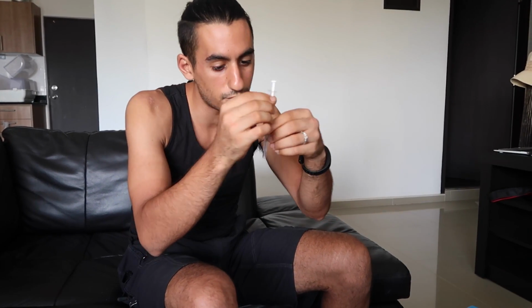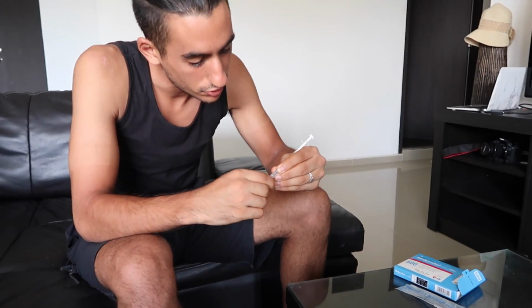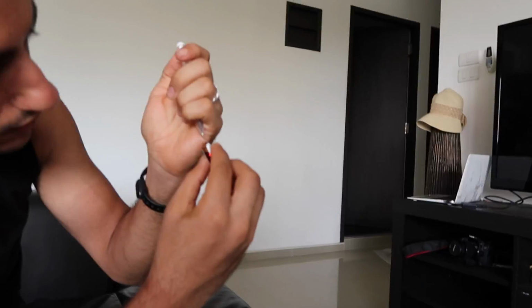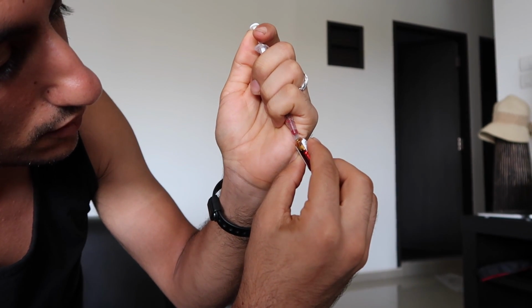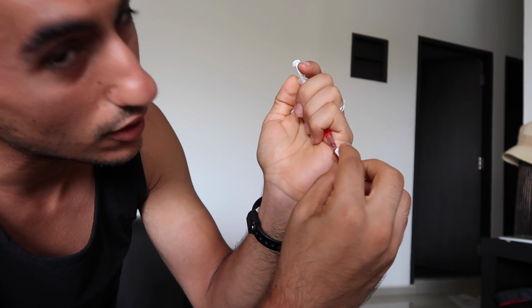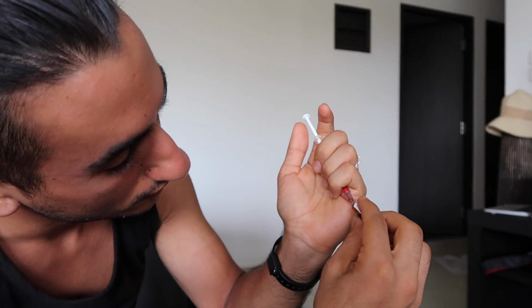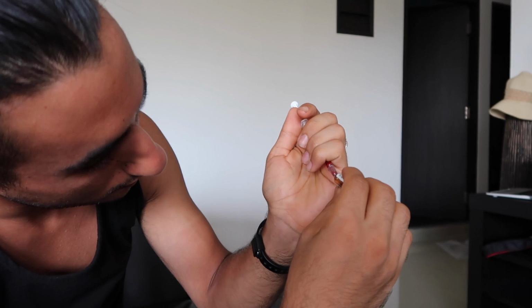The only problem with these needles is that they're not very long, so you have to angle the little vial to get it in. So let me show you how to do that. Let's pull the cap off, and then it helps to be able to see it. So we get it down here, and then slowly just start sucking it up. This is the longest and most finicky point of the whole process. Believe it or not, injecting it is really not too bad. It's just getting it in the syringe that is the troublesome element of all this.